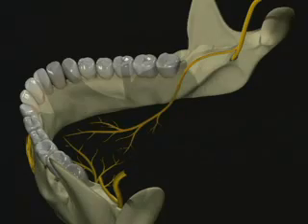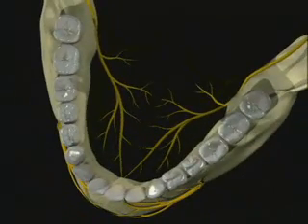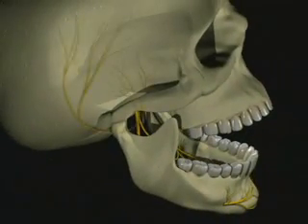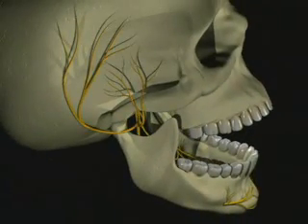The nerves anesthetized with the Gow-Gates technique include the inferior alveolar, mylohyoid, lingual, and auriculotemporal nerves. The same tissues are anesthetized as with the standard block, except that about 75% of the time the buccal nerve is also anesthetized, eliminating the need for a separate buccal injection.